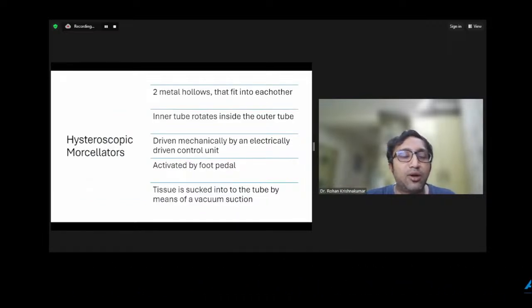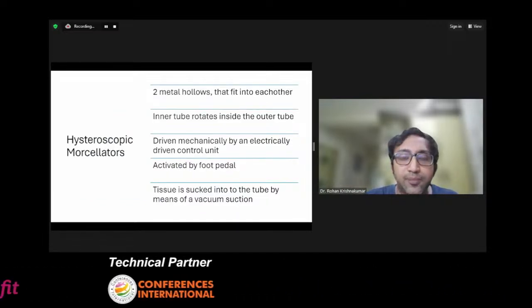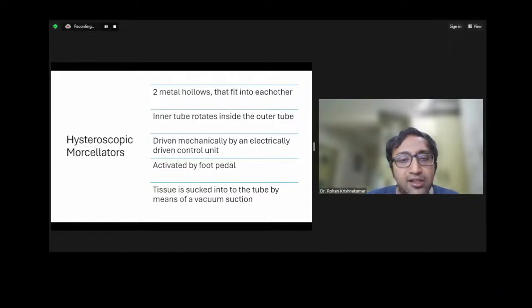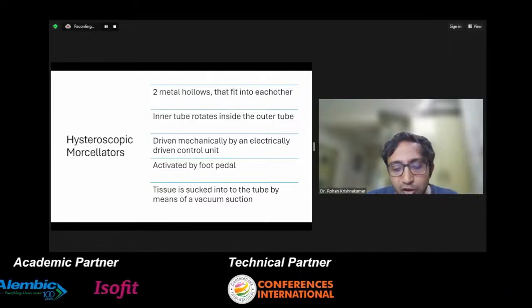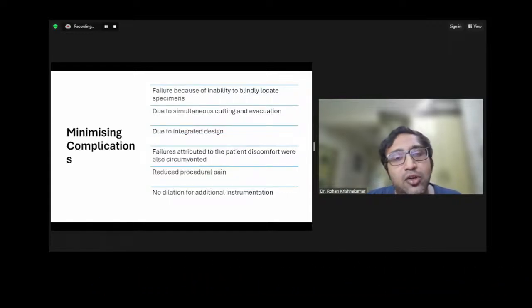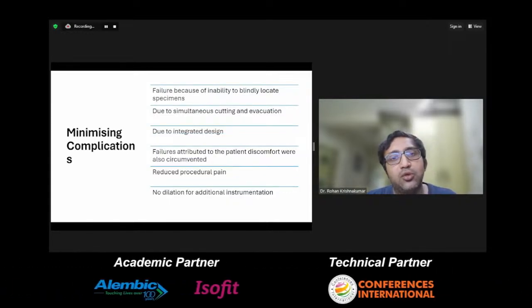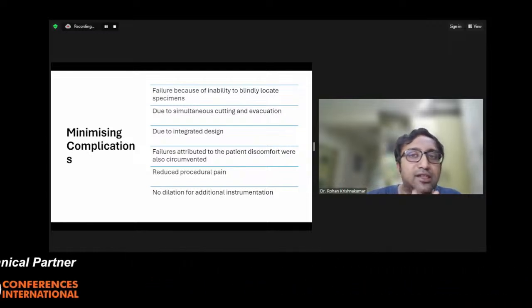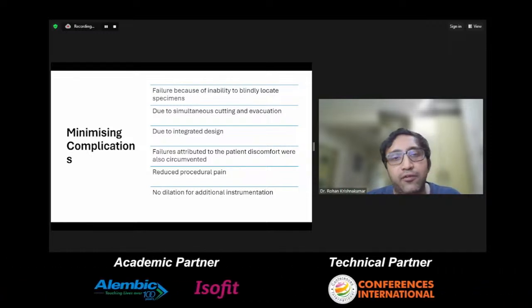So coming to these newer morcellators, there are two metal hollow tubes that fit into each other. The inner tube rotates, driven through mechanical energy activated by a foot pedal. The tissues are sucked, so the field is always clear. It also minimizes complications because you can enter directly with that. You don't have to change your instrument or dilate the uterus, keeping the field clear.